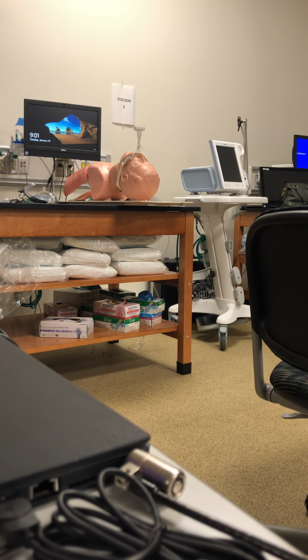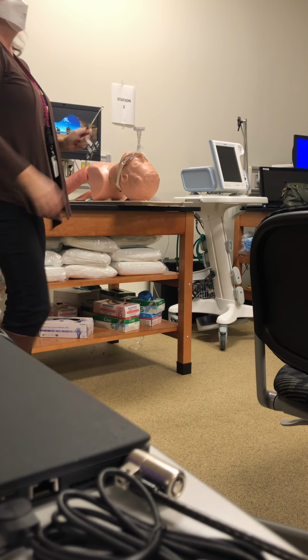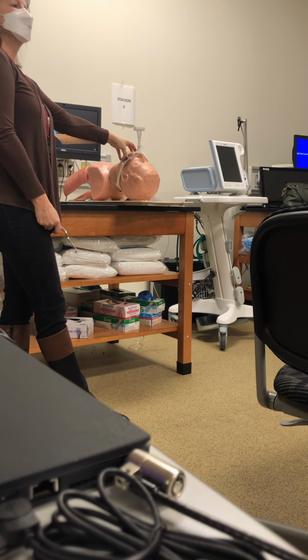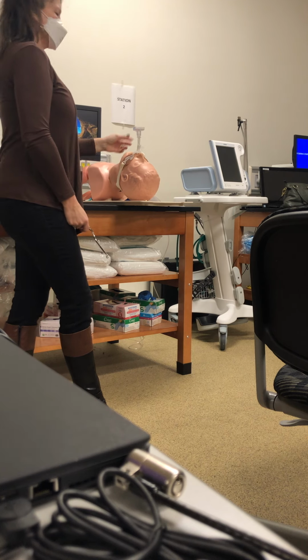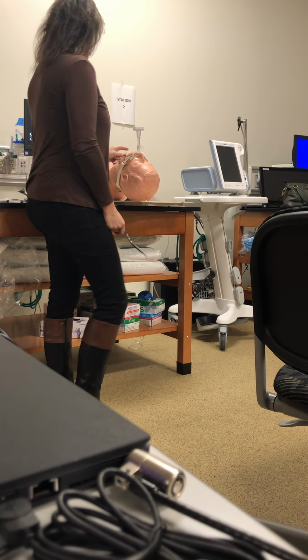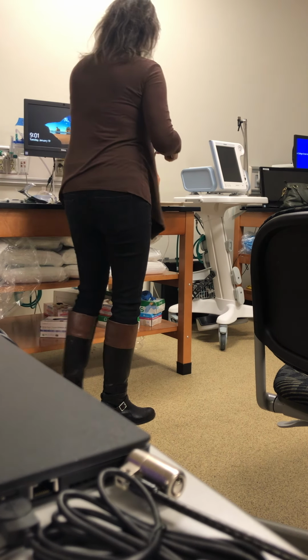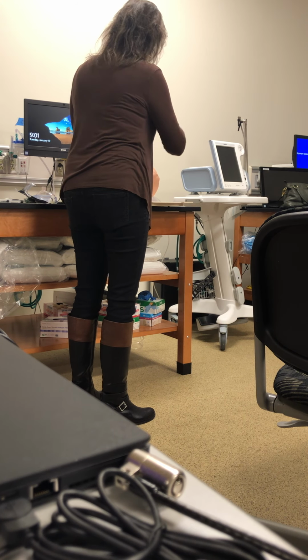So, some of this in the PowerPoint, I'm just going to go through quickly because we've talked about it. But if you were going to nasally intubate someone, let's say they had a jaw fracture and you weren't able to orally intubate them, it would be a smaller tube like a 7, okay? And you're going to lube it up really, really good. You're going to put it into their nares, in and down. And you can still use this laryngoscope so that you can lift up the base of the tongue and you can see the tube down there.